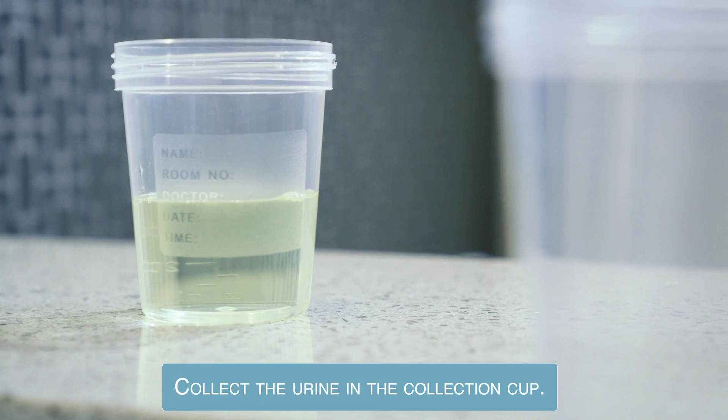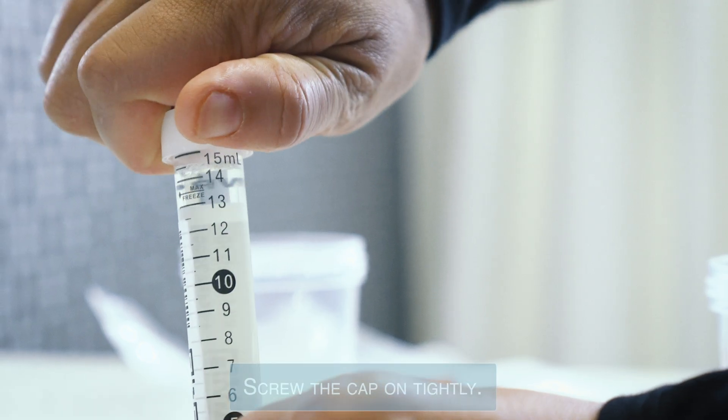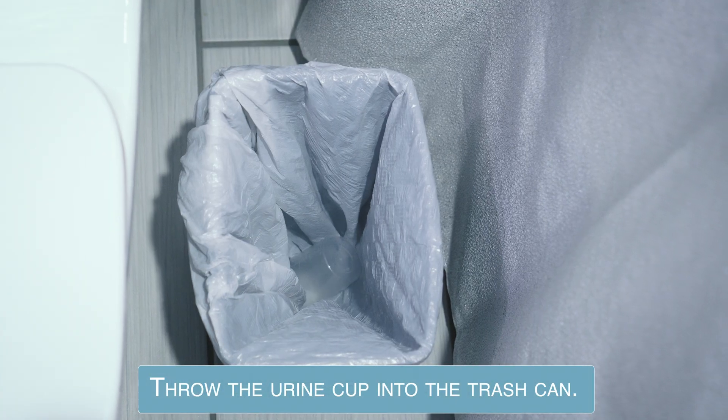Collect the urine in the collection cup. Unscrew the cap from the urine tube and fill to the 15 milliliter line. Screw the cap on tightly. Throw the urine cup into the trash can.